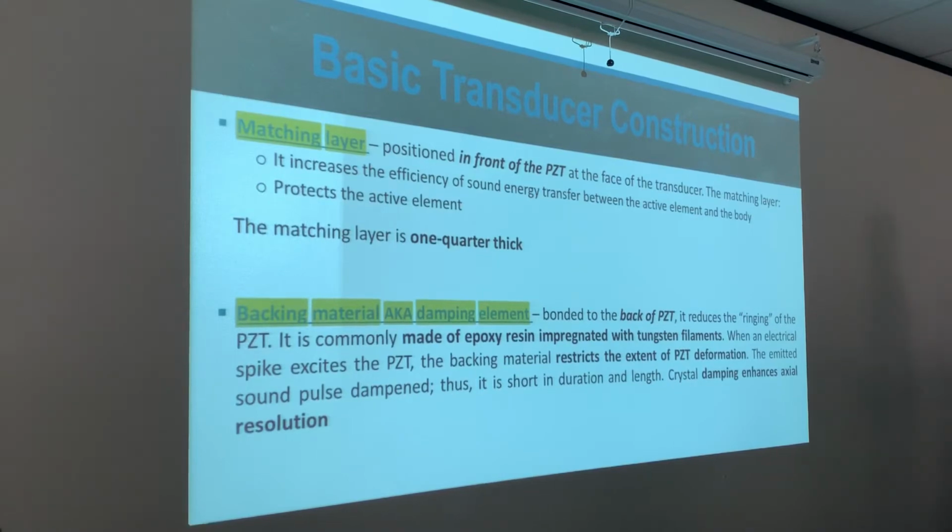With the damping, that's why, I don't know if you ever noticed, our transducers are labeled 5-1. Because that's our bandwidth, our range of frequencies. Yes, 5 is our main frequency for a curved transducer, the curvilinear transducer, but it has a range of frequency between 5 and 1. Because it can't stop the PZT from ringing instantly. From the time it's ringing to the time it stopped, it has that range of frequency within there, from it working at full speed till it stopped.